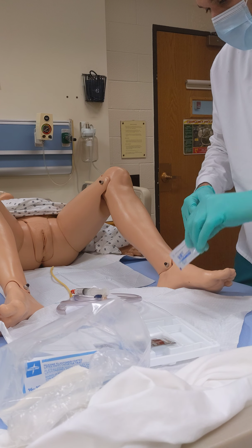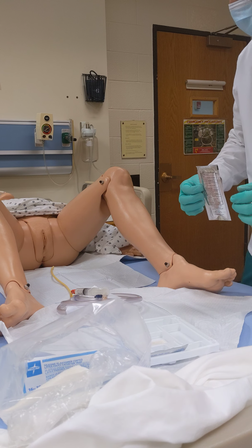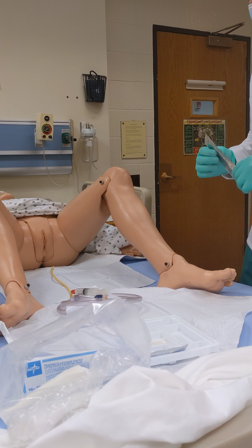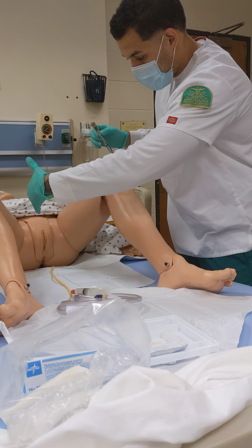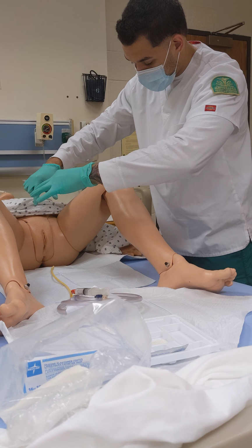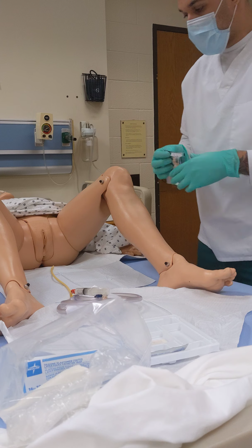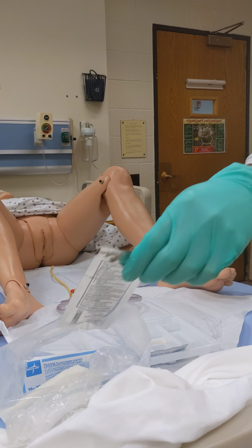I would then open the lubricant, place it in the appropriate place in the container here so that it's ready to be applied on the catheter. I would then take out the iodine swab sticks, begin by cleaning the further side, discarding the first swab, then the closest side, discarding the next swab, and then making sure that I spread the vagina so that I can clean from the meatus all the way down. And then dispose of this in the appropriate receptacle.